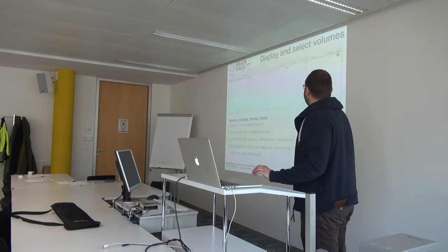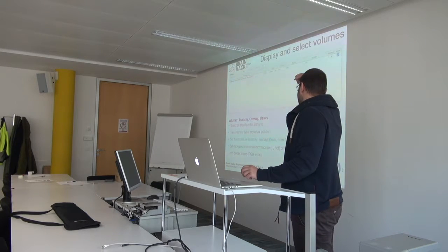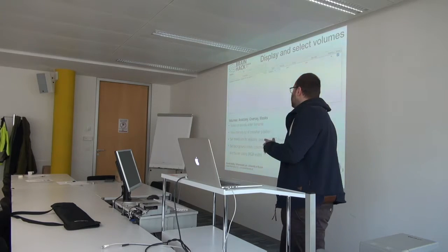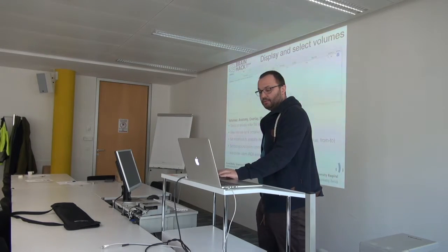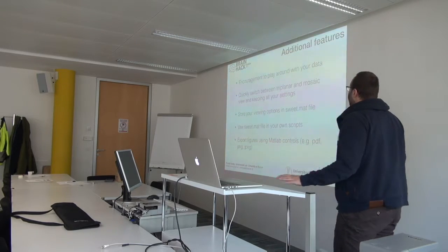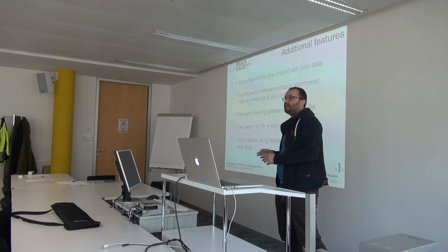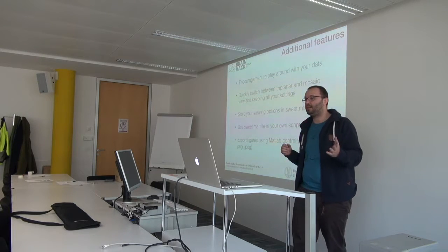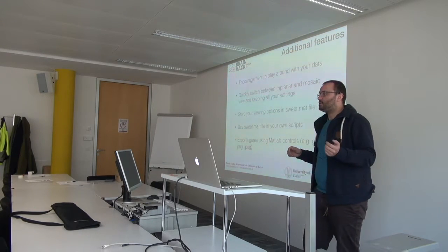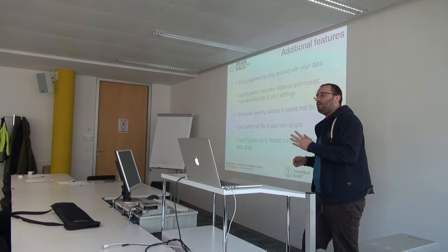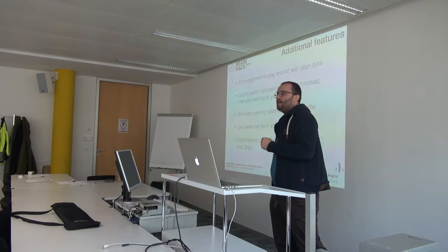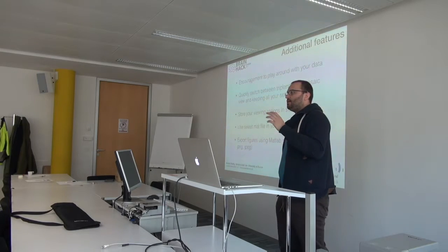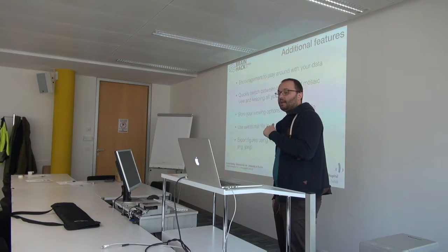For overlays you can set background colors using either a color map or a solid color — solid color makes sense for masks. You can also specify borders. The main idea is to encourage you to play around with your data quickly: change the threshold and see how it changes. For example, if you have FWE whole-brain corrected results and want to know what happens if you lower the threshold, or whether you can overlay different thresholds at the same time — yes, you can. That's the idea.